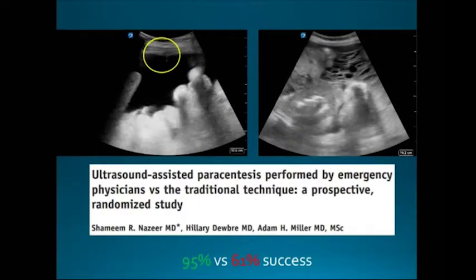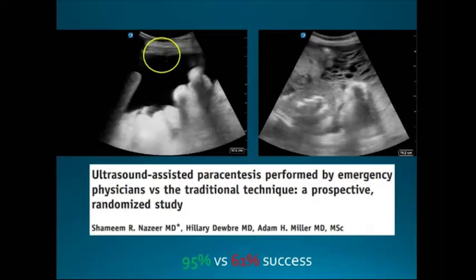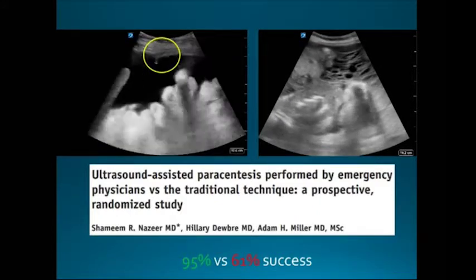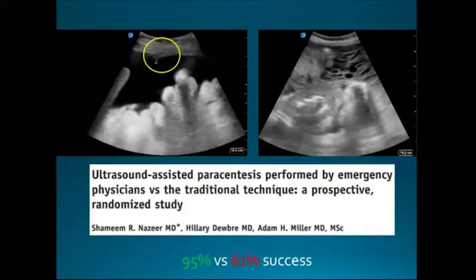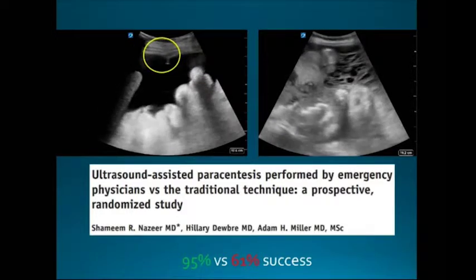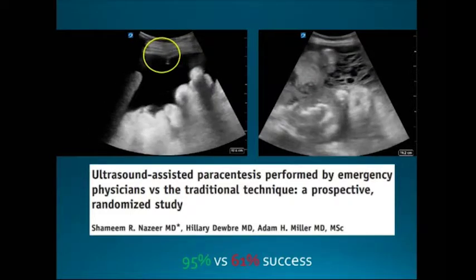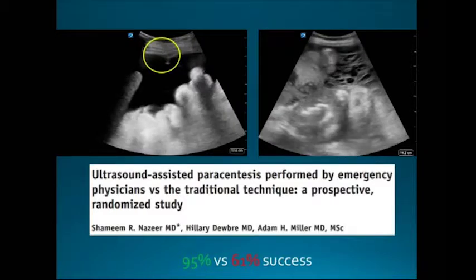Whereas this person here, this is a great example of when to avoid doing a paracentesis, right? This is a patient who had metastatic cancer, had repeated malignant ascites, TAPs, and things like that. And this has now all become very densely loculated. Intermixed in all these loculations are loops of bowel with gas and kind of swirling around. And this is not a belly you want to go and tap.